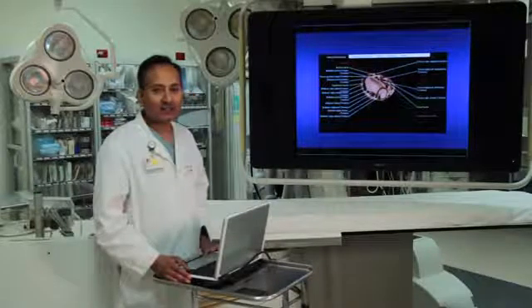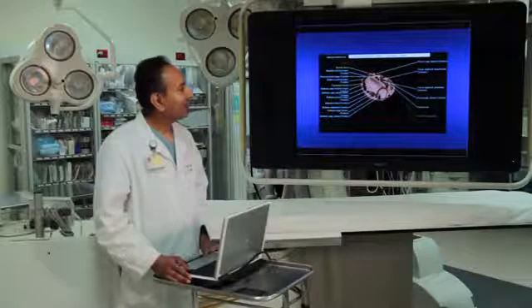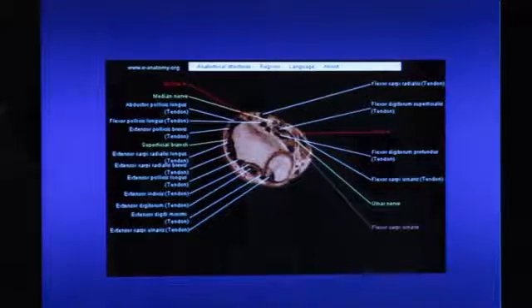Another technique which may help: as with the femoral access, we find that in older individuals, the artery can become calcified. The artery can roll from one side to another. So we're able to trap the artery using knowledge of the anatomy.